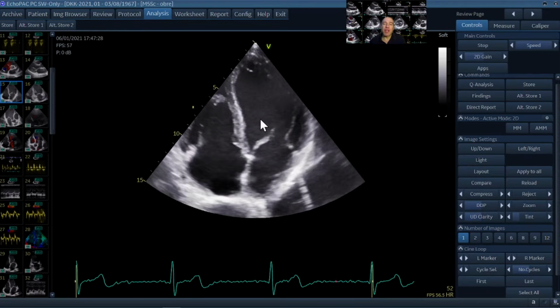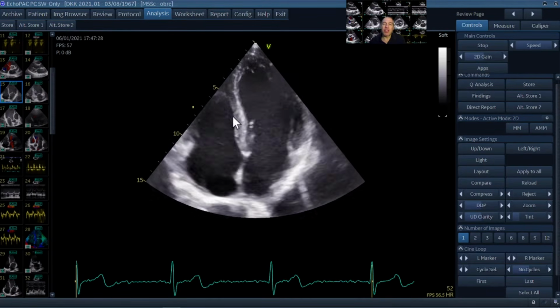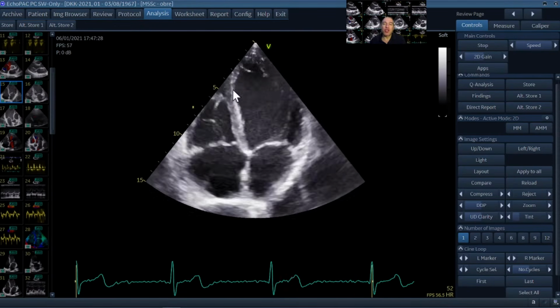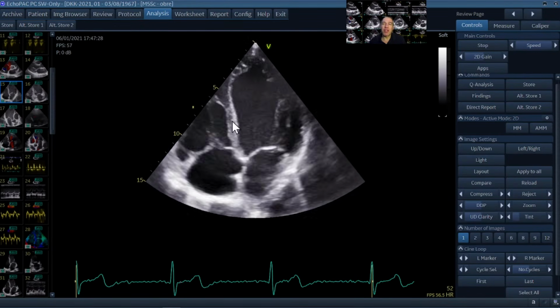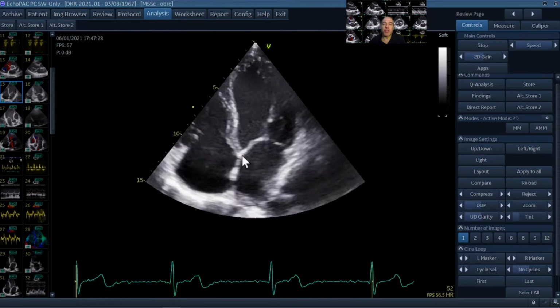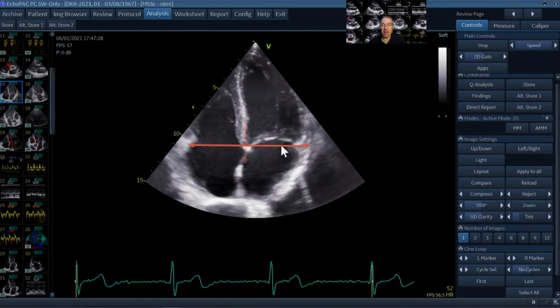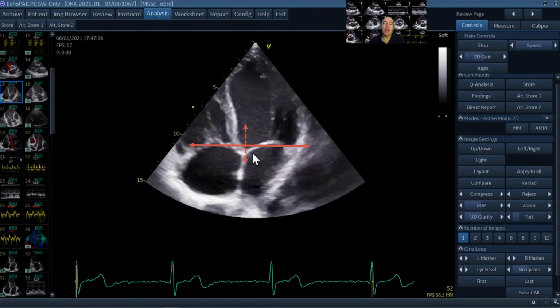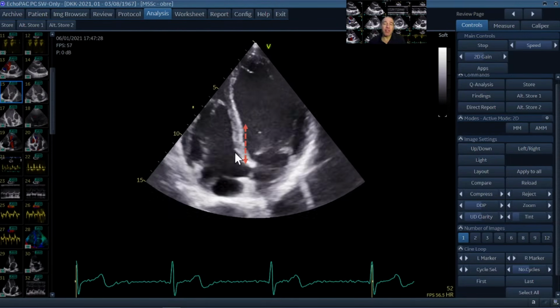So it's not only inward contraction by thickening, but there is also a shortening of the complete left ventricular cavity during myocardial contraction, and that gives rise to a displacement of the atrioventricular plane in the direction of the long axis of the ventricle.